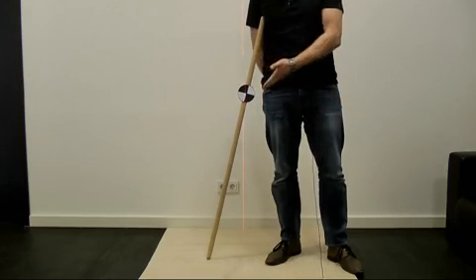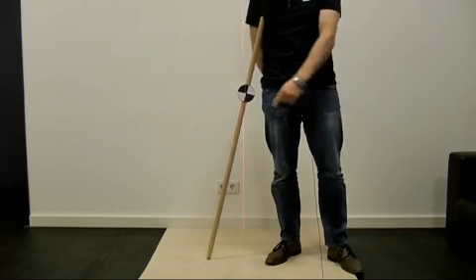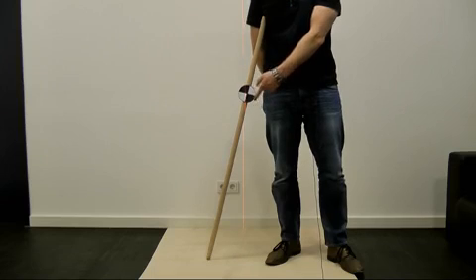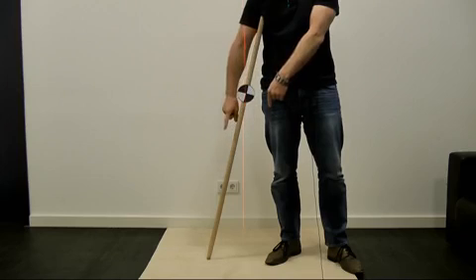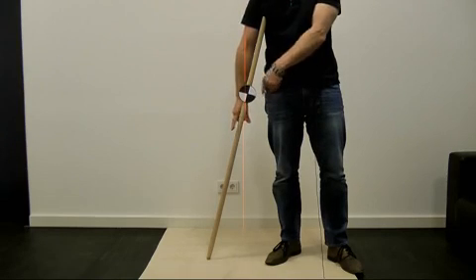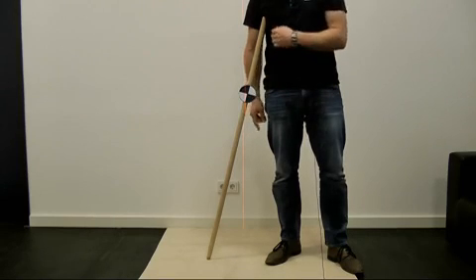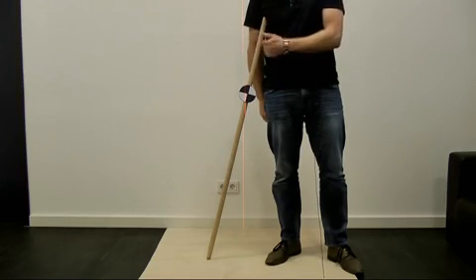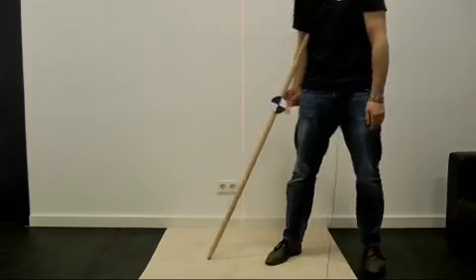Let's try. If you drop a plumb line from the center of gravity of your body, we see that the plumb line falls between the end of the broomstick and me. That means, at this moment, I am an active part of this whole structure and provide stability to the broomstick. As a result, if I go away, the broomstick falls over. It is not able to stand on its own.